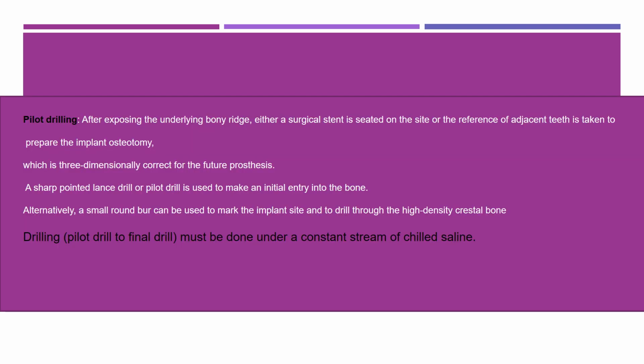And coming to the next, there is pilot drilling. So there is the initial drill. It can be called a lance drill or locator drill, or anything. It will be just 2 mm in width, and it will be drilled to the depth. So this is the initial drill, the initial point.